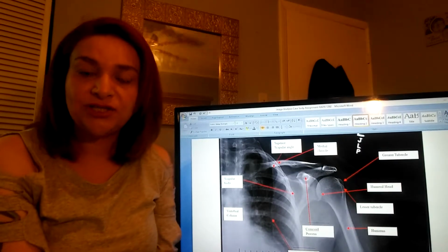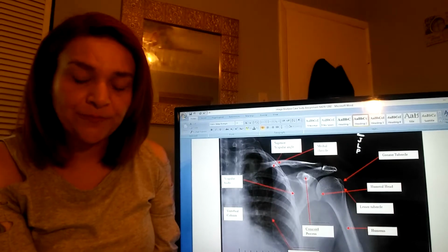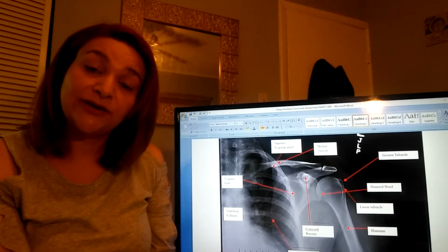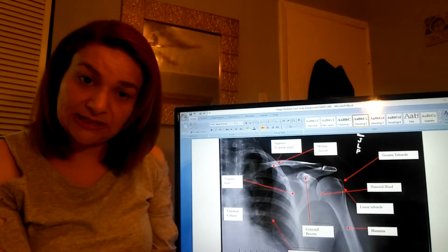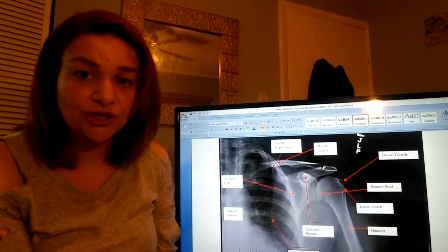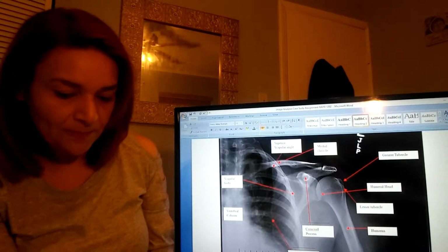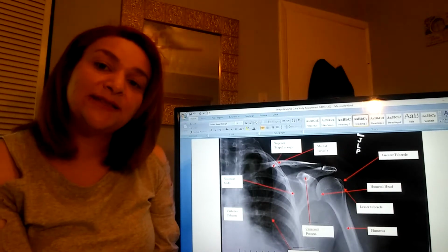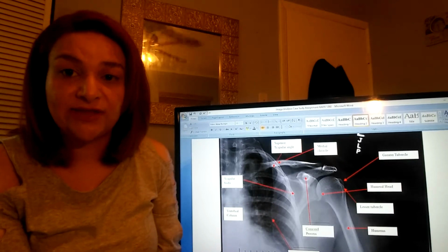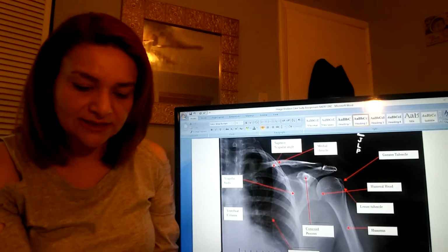Now, she did walk into the X-ray room, and I greeted her and let her know that my name is Jamie and I was an X-ray student at El Centro. I did get her date of birth to ensure I had the correct patient, and I explained the different positions for the projections and let her know that everything was going to take about 10 to 15 minutes.